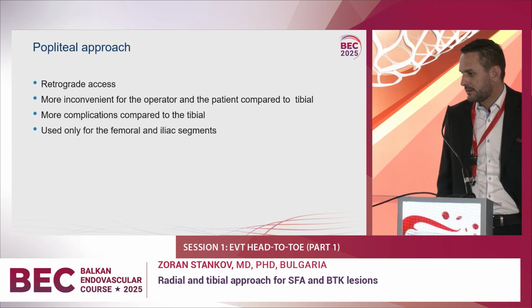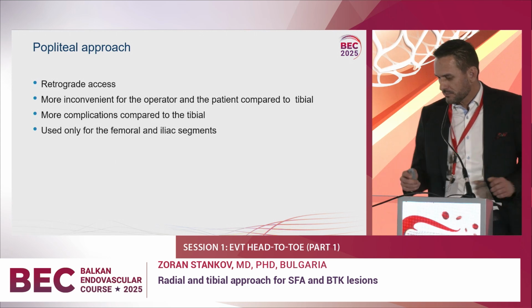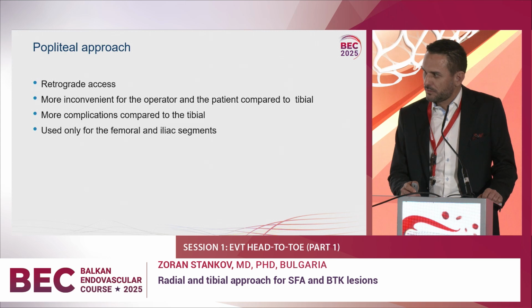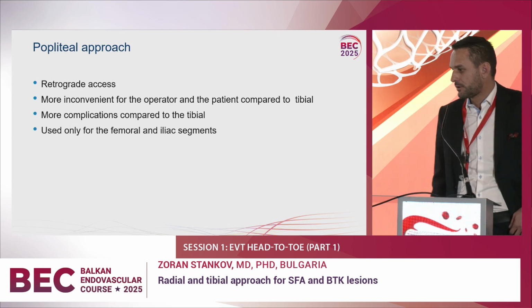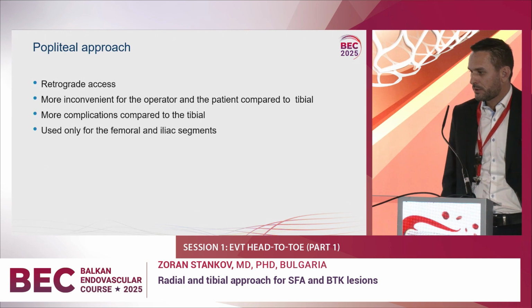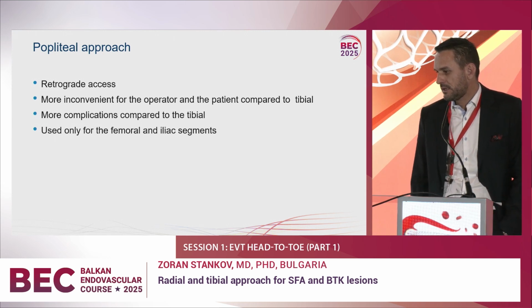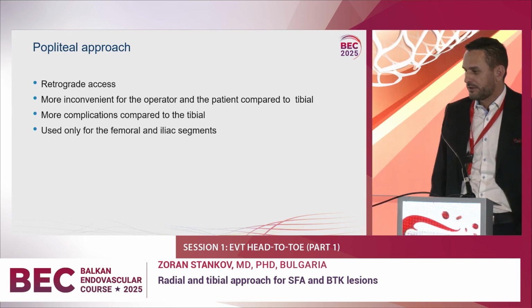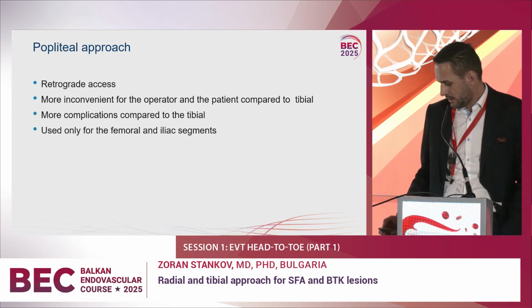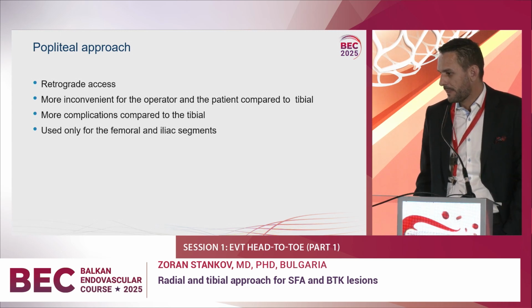Popliteal approach is a retrograde access, but it's less comfortable for the operator and for the patient compared to the tibial, with more complications compared to the tibial access. We use it only for the femoral and iliac segment. It cannot be used for tibial artery lesions.